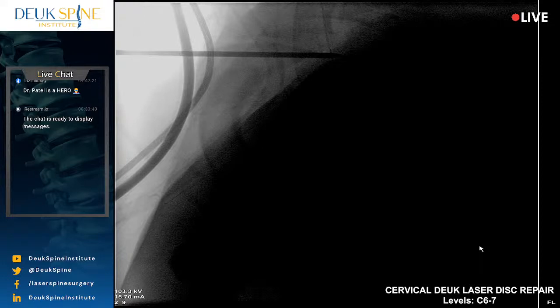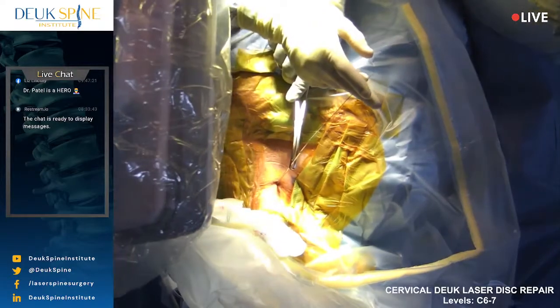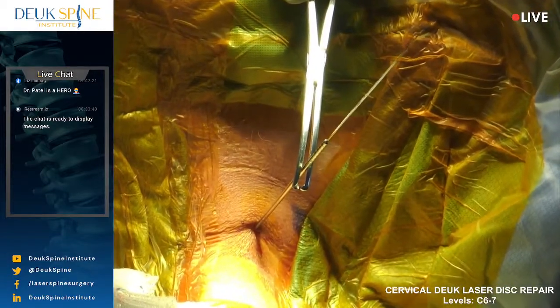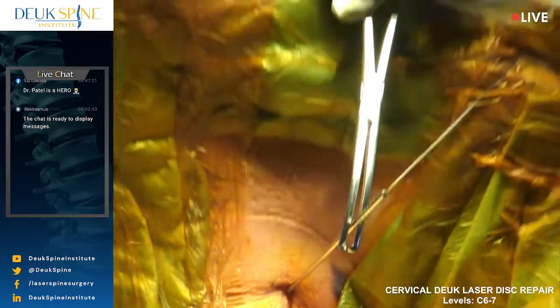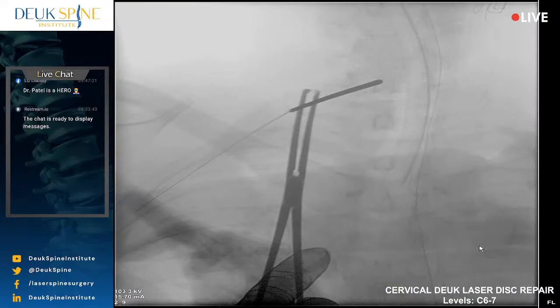So to summarize, because this patient's anatomy is a bit unique, that looks good. Go back to a lateral. I now have the dilator tip right in the center of the spine. I just need to get it over the soft part of the front of the disc where there's no bone spur. And then I can enter the disc. And to do that, his shoulders are absolutely huge. They're blocking the x-ray. They're making it very difficult to see anything. So I'm going to have to use this x-ray to maneuver on the lateral view. And let's get a shot.